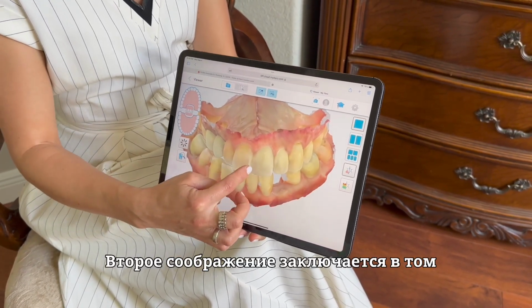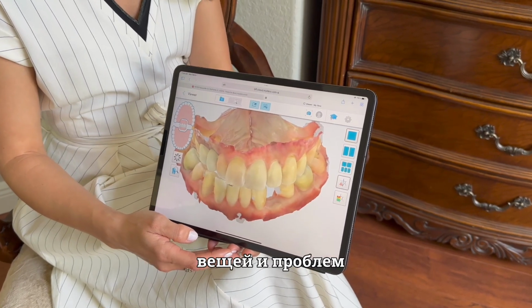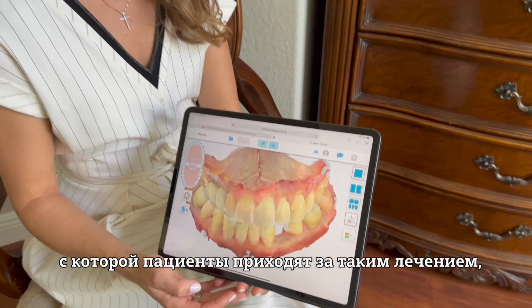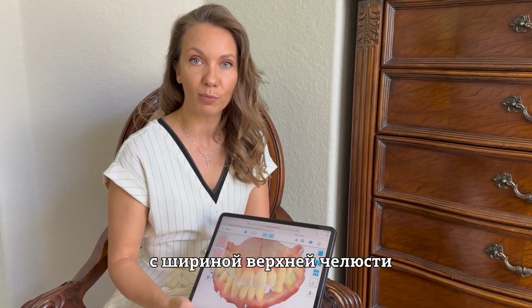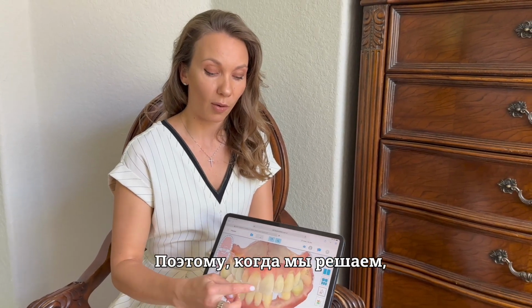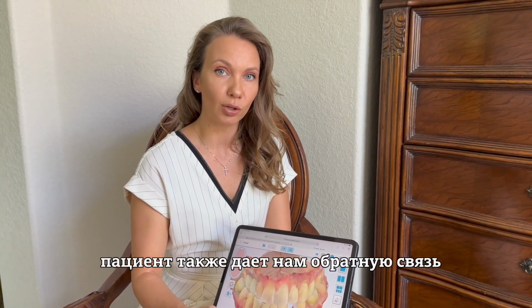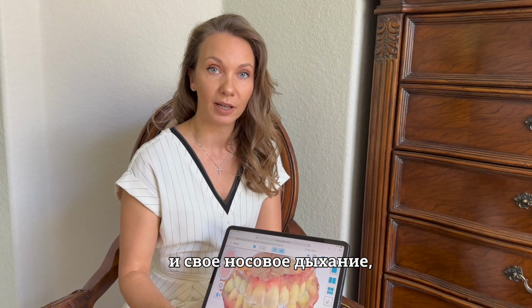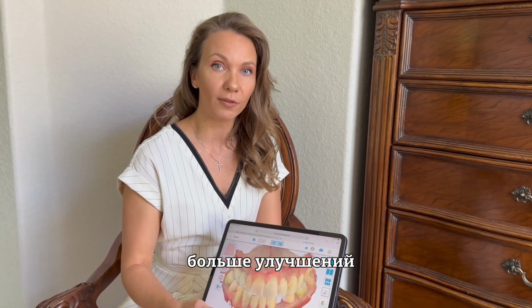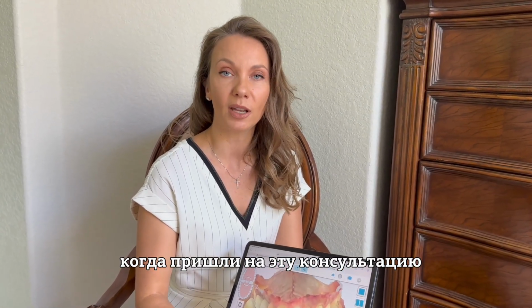The second consideration is how much the patient wants to have her improvement in terms of breathing, because one of the most important problems that our patients come seeking this type of treatment for is to improve their breathing, which is directly associated with the width of the maxillary bone and the base of the nasal cavity. So when we decide on the amount of expansion in this type of patient, it's also the patient who gives us the feedback on how much they want to have their nasal breathing improved. If they still need more, if they still want more improvement and more airway volume within their nasal passages compared to the condition when they first came in for this type of consultation.